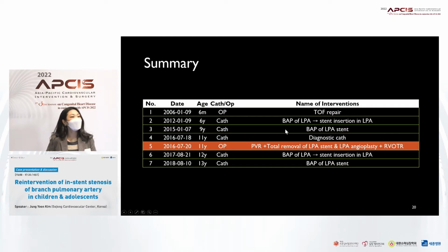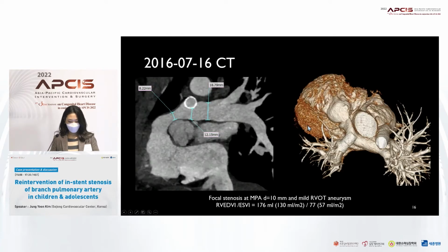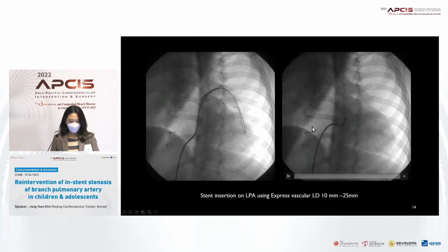I want to mention your procedure because it depends on your stent. I think that stent is a pre-mounted 10 millimeter stent. I experienced that after redilation with a 12 millimeter balloon, the stent fragmented and embolized. So I worry very much about fragmentation.